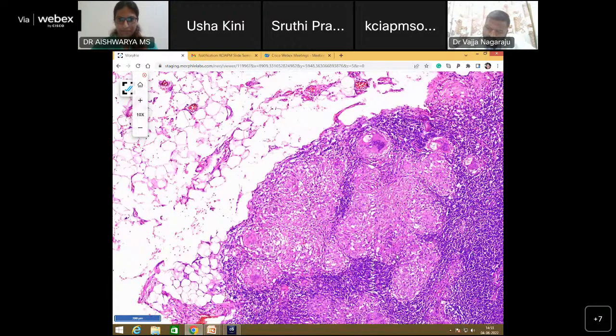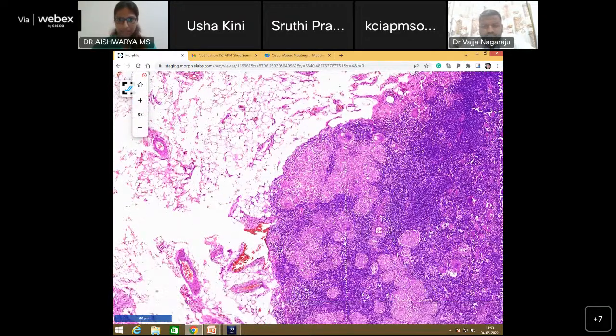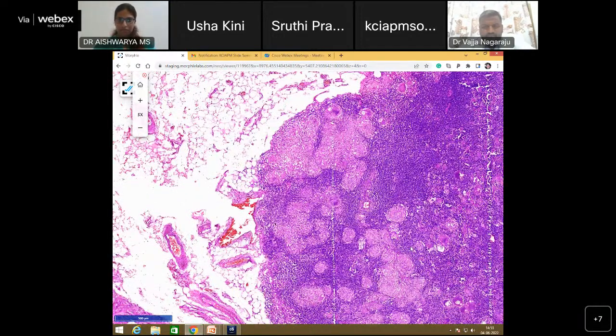There are multiple small ones and some have become confluent, and you have your giant cells scattered all through. There's no definite place for them. So apart from this, I think your points were very well taken.